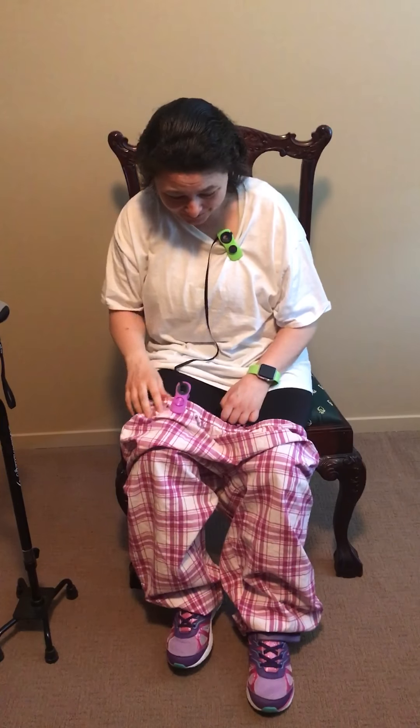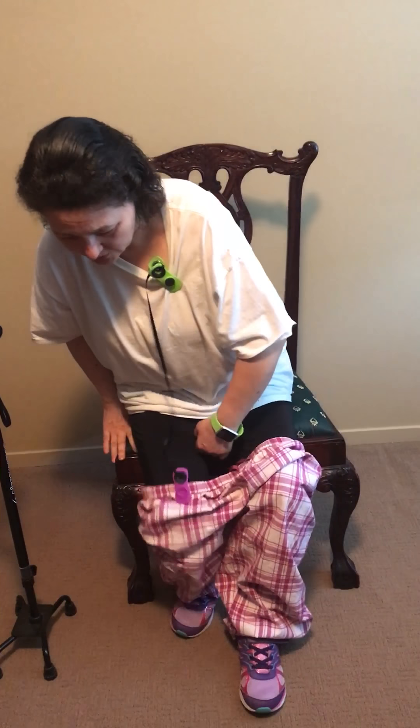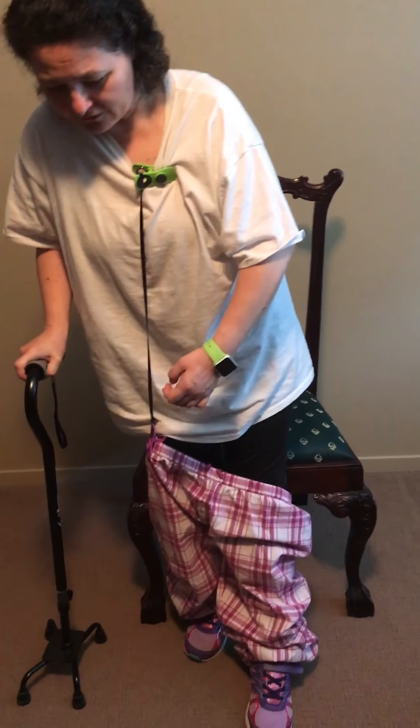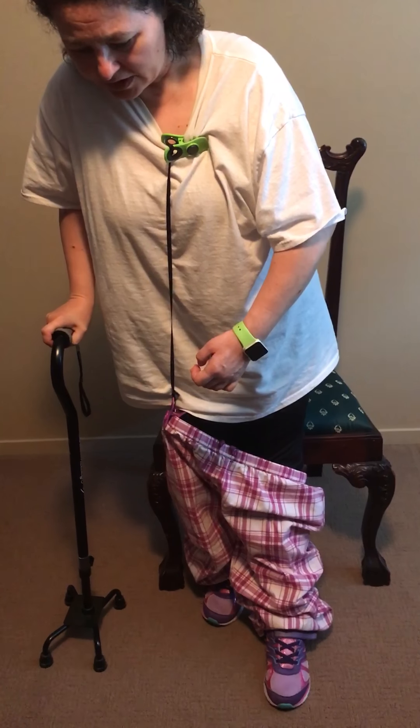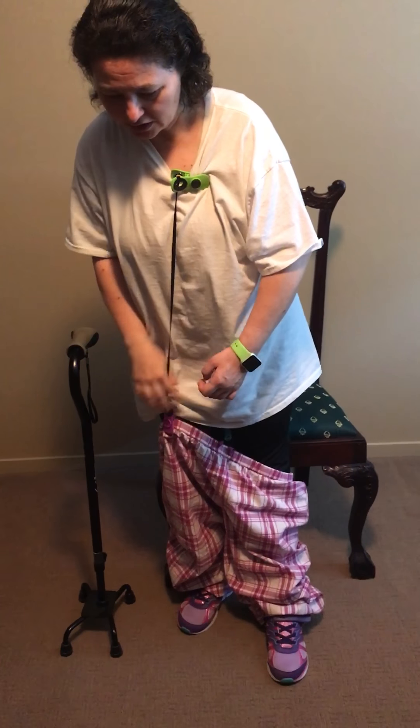That's pretty much as easy as it is. Once you have it all attached, you get up — and don't worry, I'm wearing leggings so you're not going to see my pasty white legs. All you have to do is stand up, and the clip will keep your pants from sliding too far down. They will go to the end of the string.